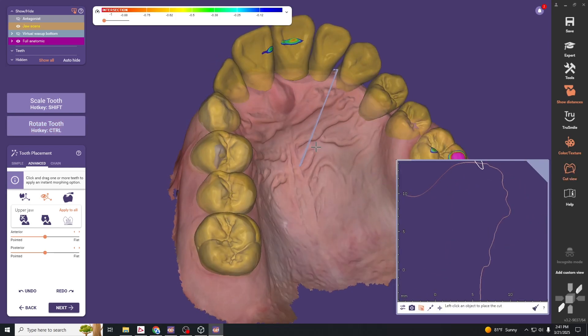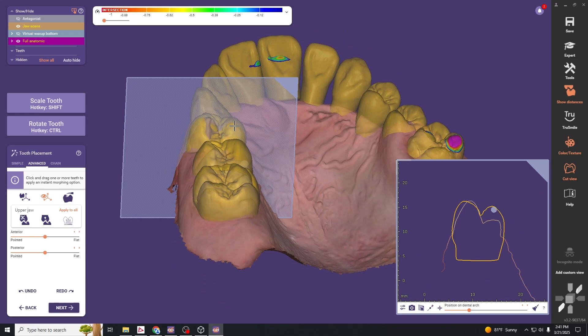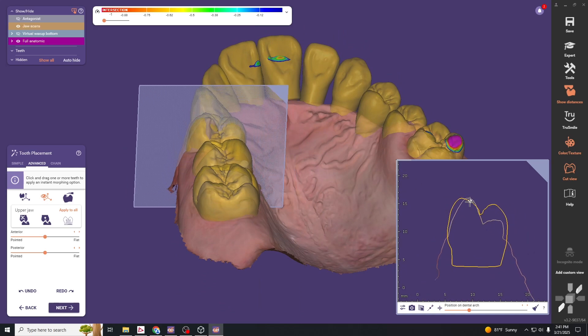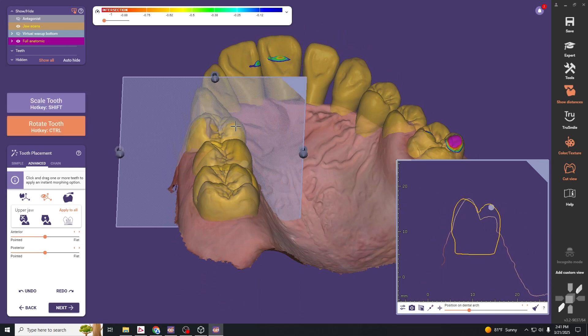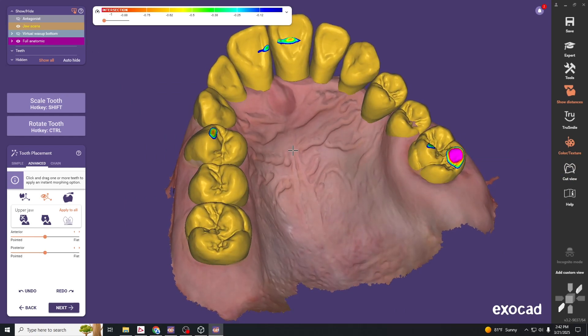You can also use the cut view — for example, to line up the wax-up cusp tip over the cusp tip of the natural tooth. Use the cut view to visualize that alignment, then go back and rescale to the proper occlusal contacts.